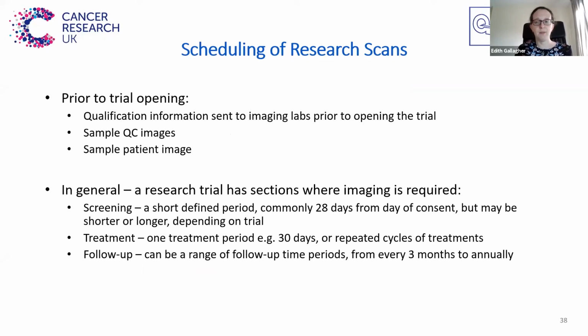Many trials that have imaging as part of the trial will require the department to undergo a qualification procedure for each camera that will be imaging patients. The comprehensiveness may depend on how much the imaging is part of the trial question and outcomes. For standard of care imaging that is being performed as part of a trial, information on the cameras that will be used may be sufficient.